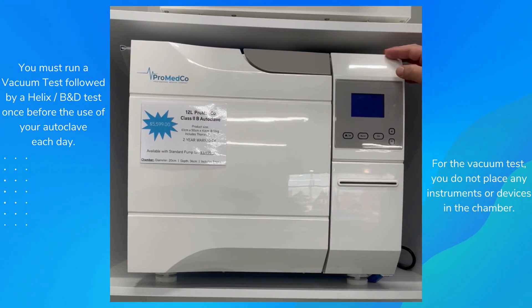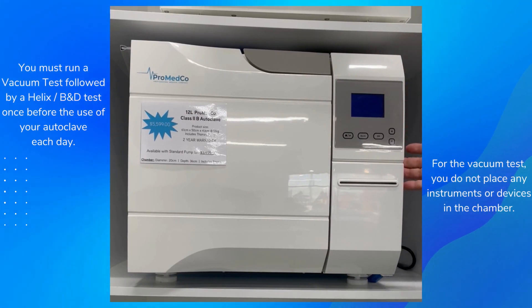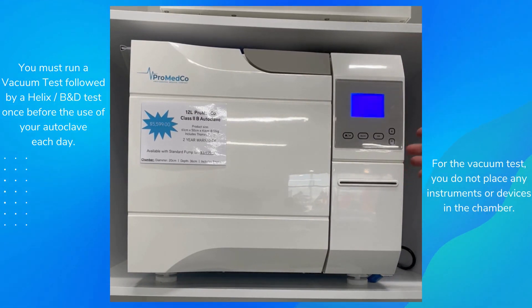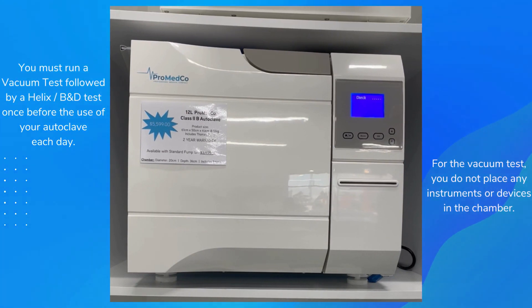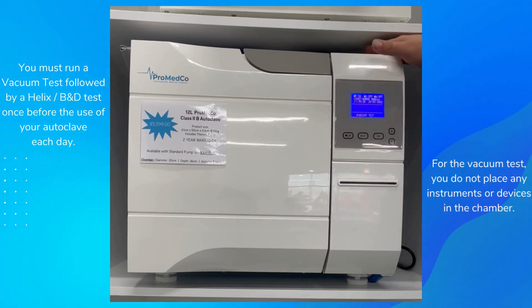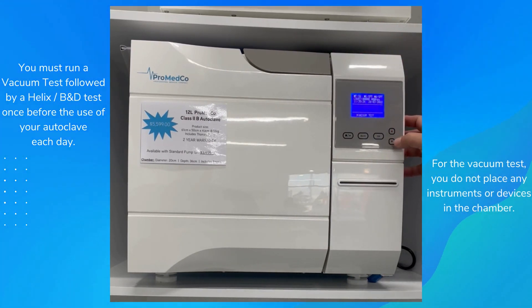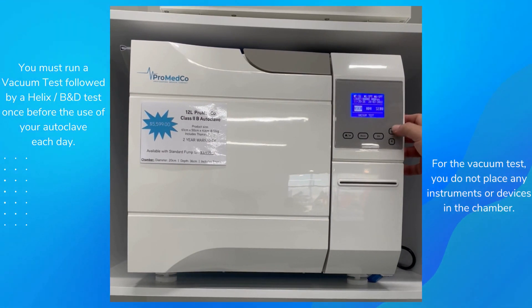Today I'm going to show you how to use the machine. First we're going to turn it on and run a vacuum test. On the side, turn the machine on — it'll go to the main screen. Disregard where it says 'fill water'; that's only because it needs water inside the tank. Once it's got water, that message won't appear.